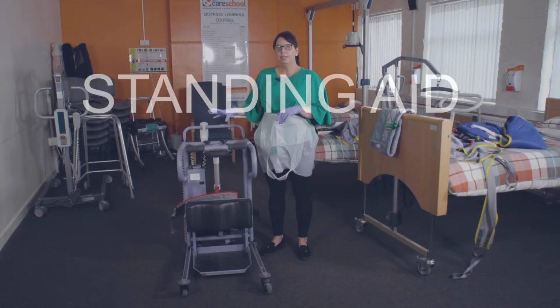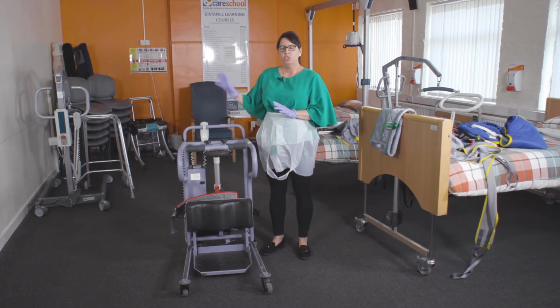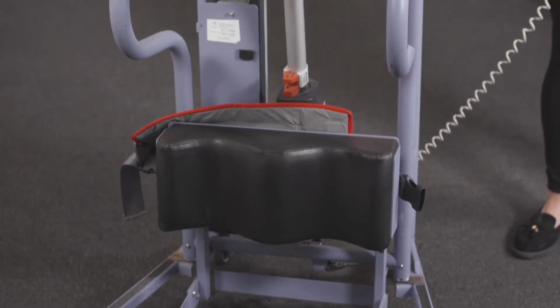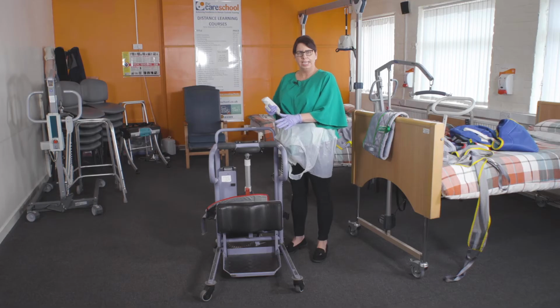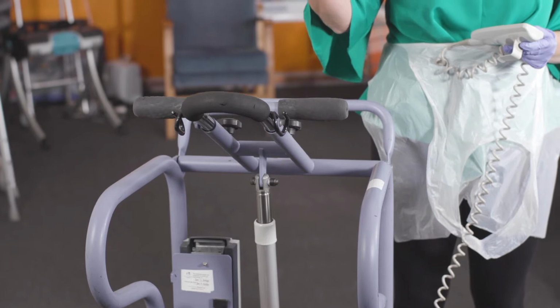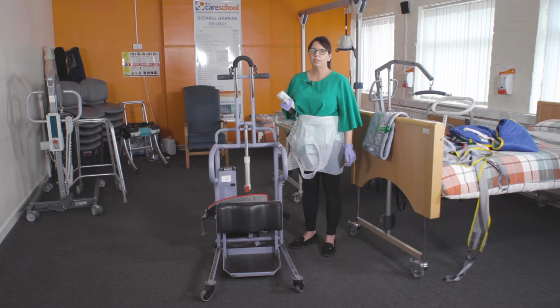Okay, so the next bit of equipment that we're going to show you is the standing aid. The standing aid is suitable for somebody who does have some weight bearing mobility but is not able to perform the sit to stand themselves. The standing aid is designed to lift somebody up into a standing position. It then enables the carer to manoeuvre and transfer the service user to the correct seated position.